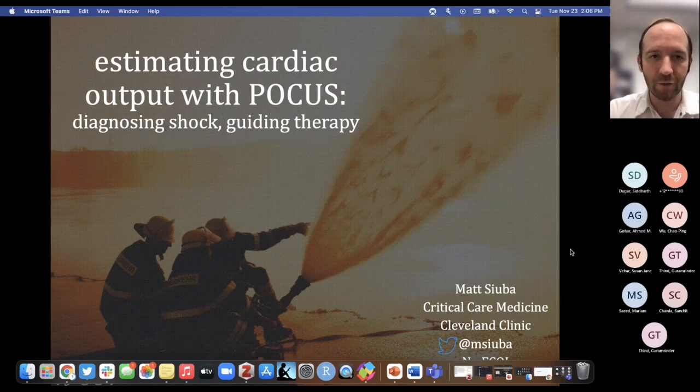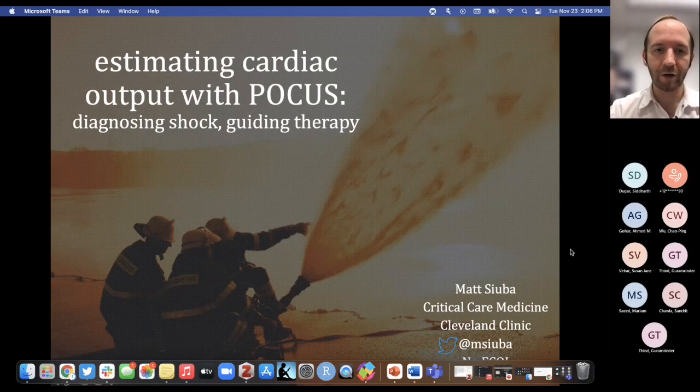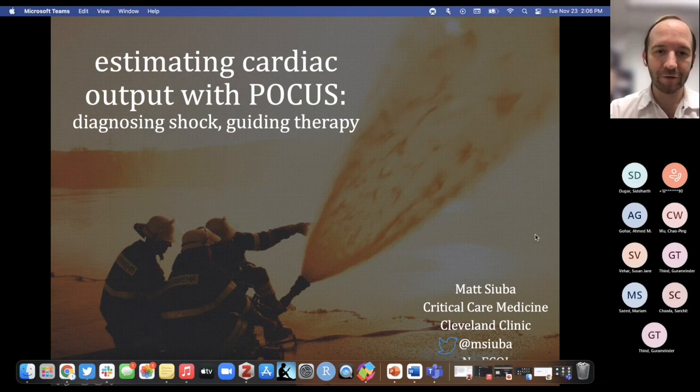Today we're going to talk about estimating cardiac output with point-of-care ultrasound for the purposes of diagnosing shock as well as guiding therapy.